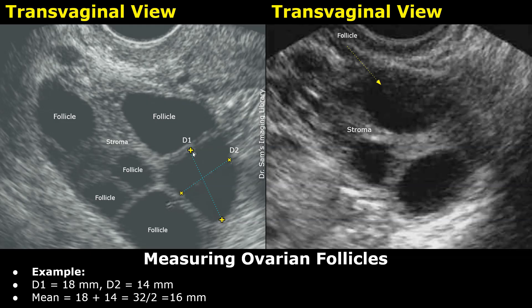First we place one set of calipers on the maximal dimension at the inner walls of the follicle, and the second set of calipers must be placed perpendicular to the first set. The longer measurement is diameter 1, or D1, and the second measurement is D2. D1 measures 18 millimeters and D2 measures 14 millimeters. The mean diameter is (18 + 14) / 2 = 32 / 2 = 16 millimeters.